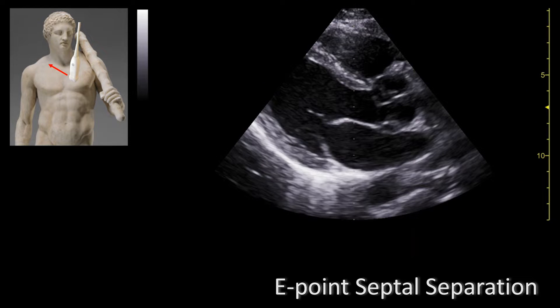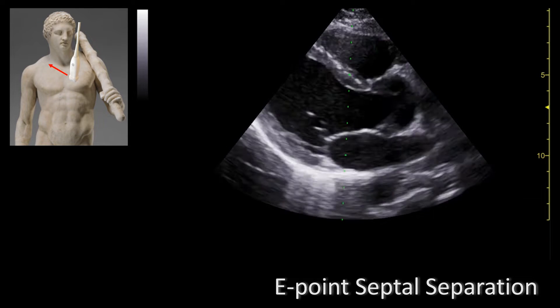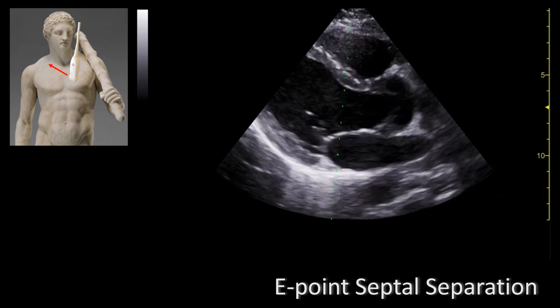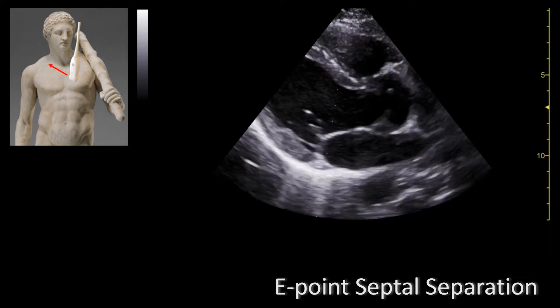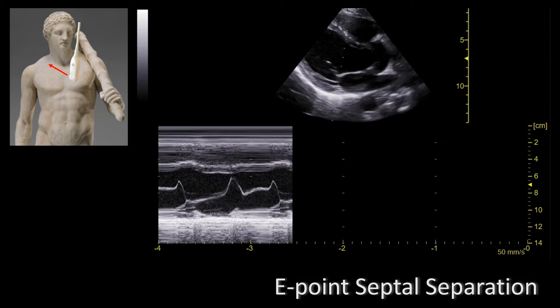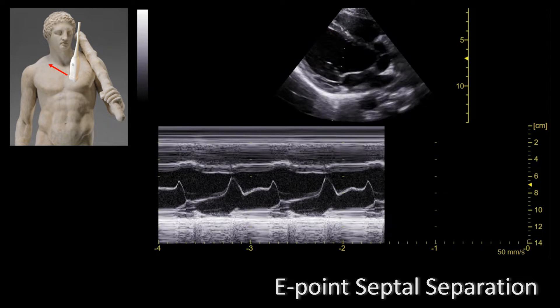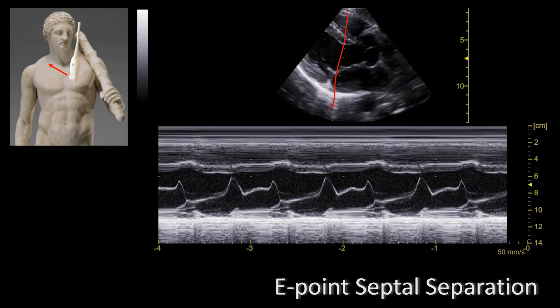After getting a good view of the mitral valve and the septum in the parasternal long axis view, you select M-mode on your ultrasound. You place the M-mode vector right through the tip of the mitral valve, which is right here. This is the tracing that you will get.